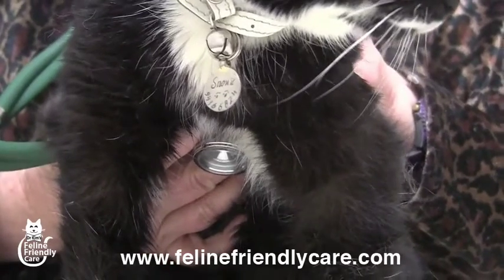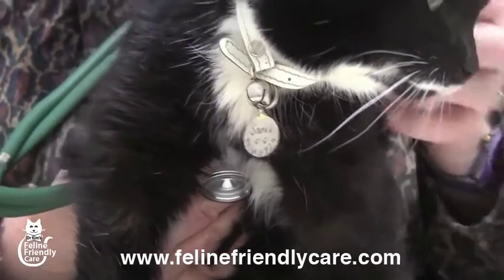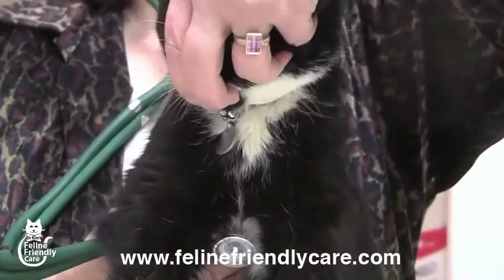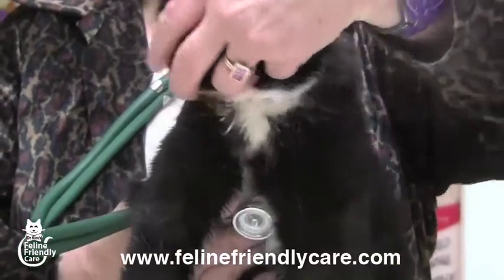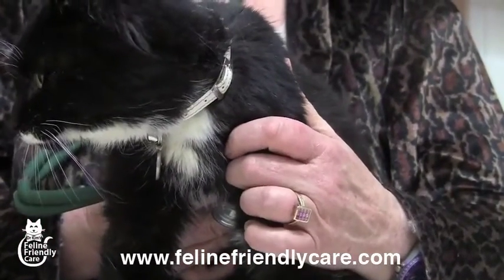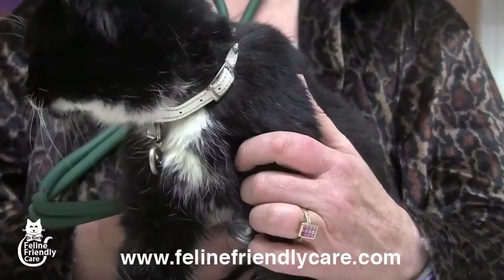This cat's purring, which makes it quite difficult to hear the heart. There are a couple of things you can do. She doesn't like it much, but if you close the nostrils off, you can get three or four beats. Or you can show the cat water, and they will nearly always stop purring while they look at the running water.